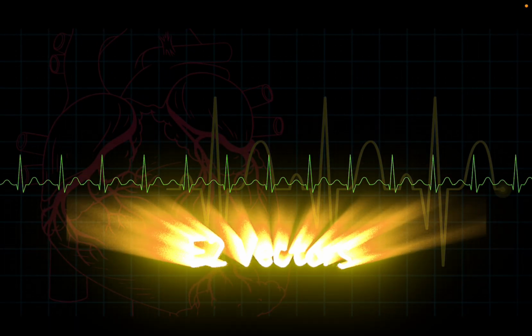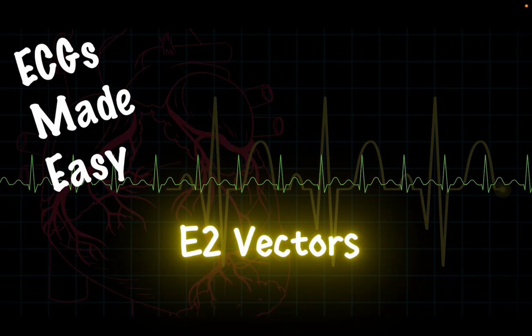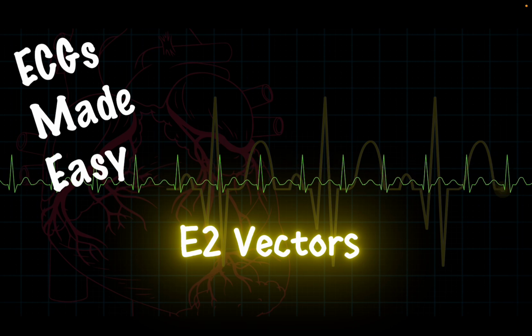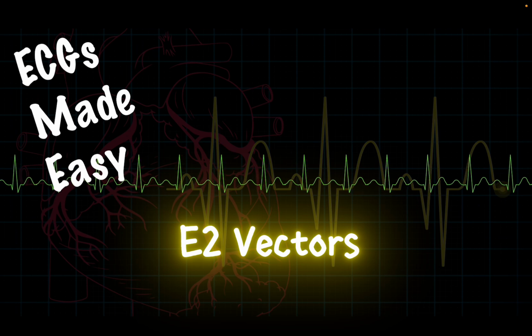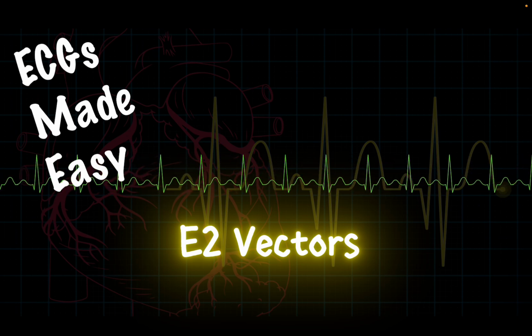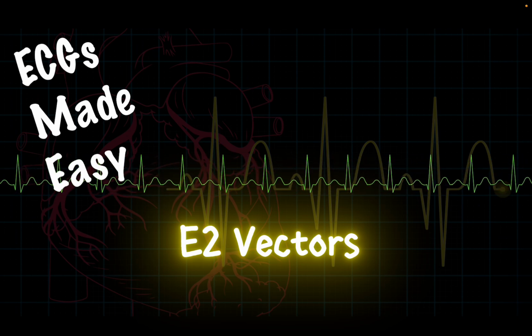Now, you don't technically need to understand vectors to understand EKGs, but I feel like the why is important, so you're not just memorizing little squiggly lines on the monitor, you really understand what's going on.